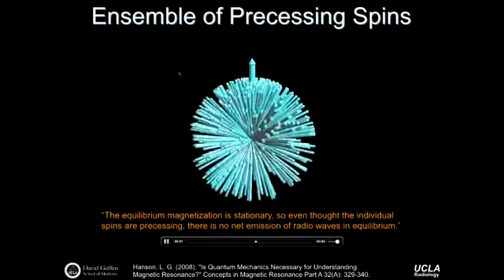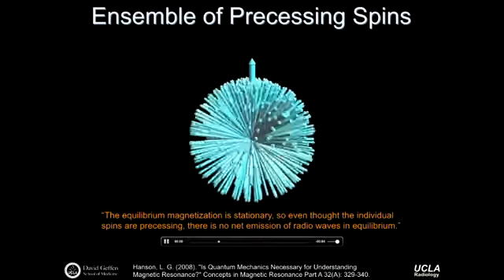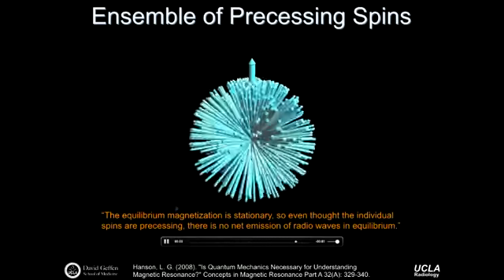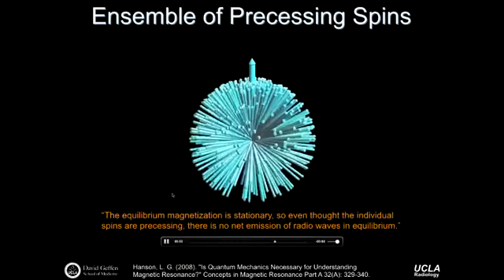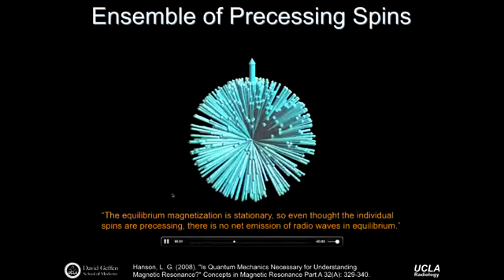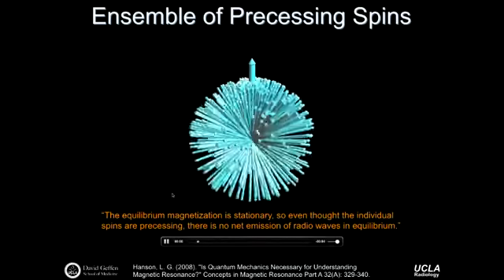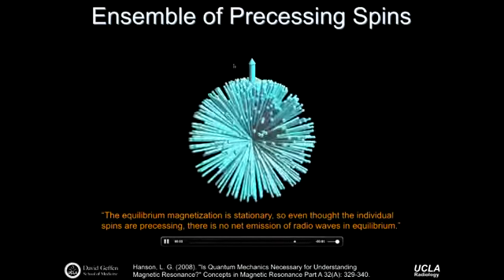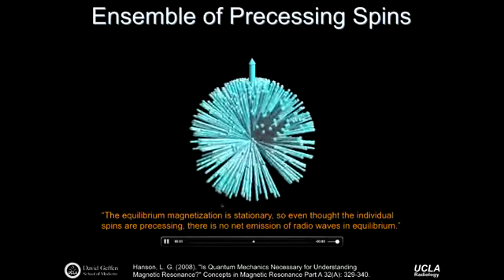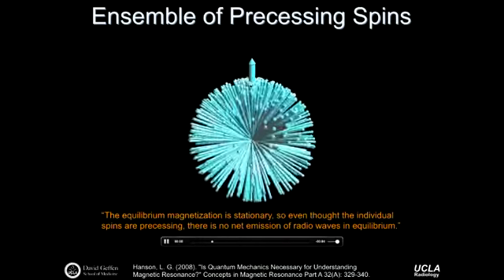So picture a tube of water lying in a scanner. It's got billions and billions of magnetic dipoles. If you look at this carefully, there's slightly more in the spin-up state, say pointing this way, and slightly fewer in the spin-down state. Now, according to how he depicts it, they're not strictly in the spin-up or spin-down state because things get thermally bumped around as well. And this is where you have this hard time linking between quantum and classical physics. Bottom line, you have something like this at the bulk magnetization level, meaning it's the ensemble behavior of a bunch of magnetic dipoles, and that so-called Zeeman splitting phenomenon gives you a net bias in a single direction.